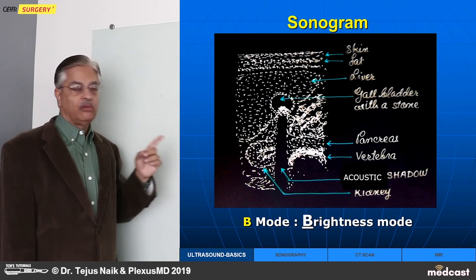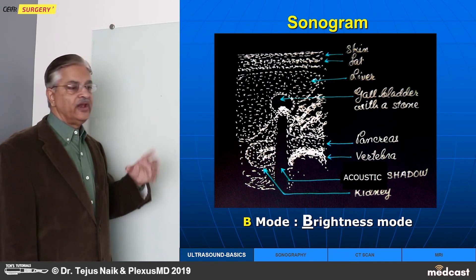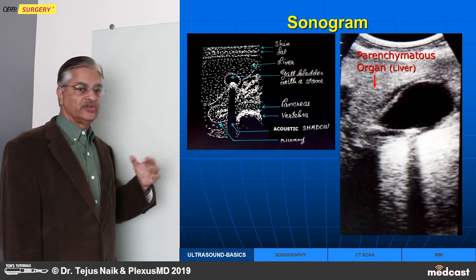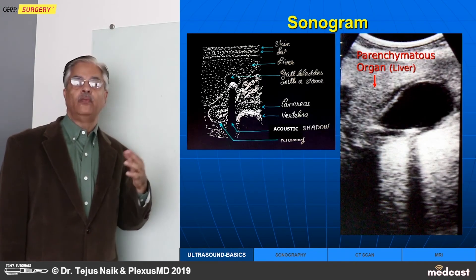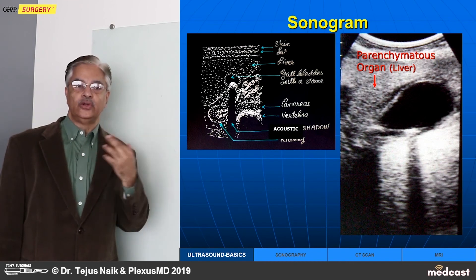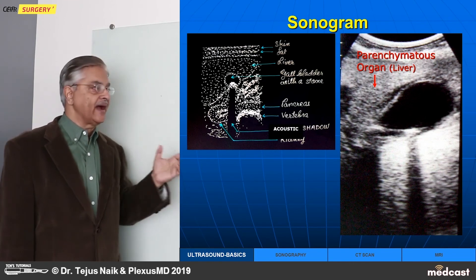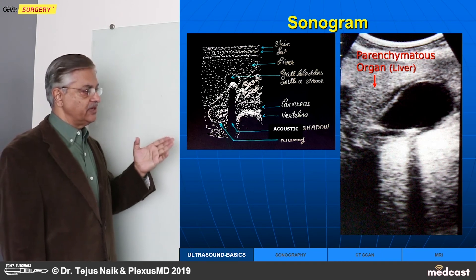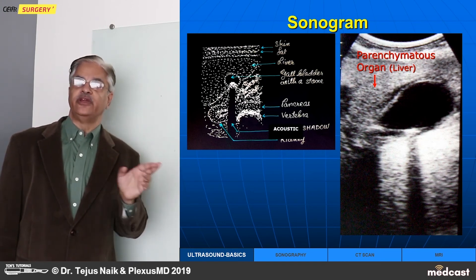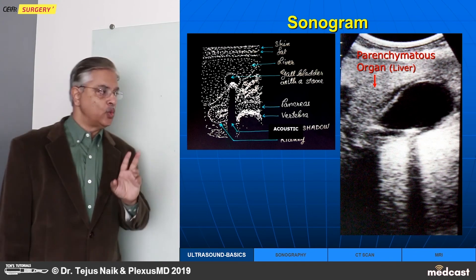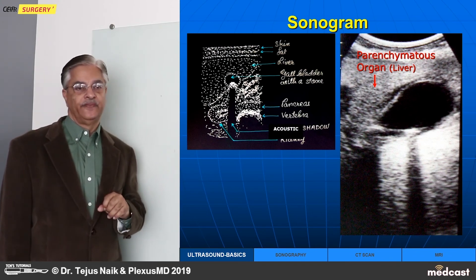This shows the gallbladder. Because fluid will not have any echoes, the fluid is without echo, or echolucent, and that is why it is generally black. This picture is negative, that is why it is black. It can be turned into a positive film in which the fluid would be seen as white, but conventionally this is how it is shown.